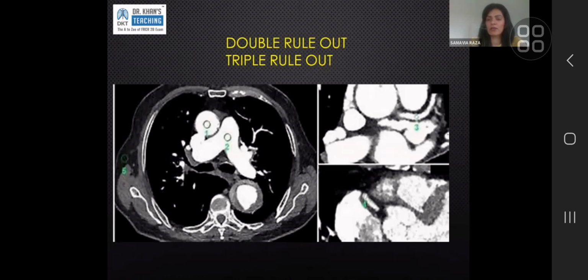So you would reduce the rate of contrast and increase the volume, and you would do it like an aorta. So you would have opacified the descending aorta, and by that time, there is still contrast coming into the right heart. So you have opacified both sides of the heart.